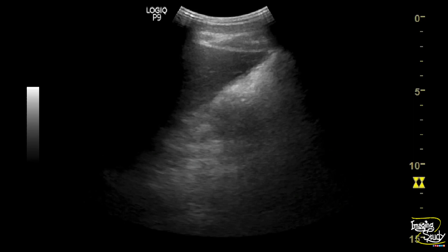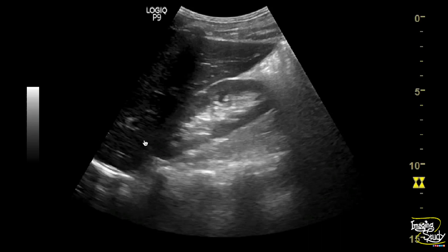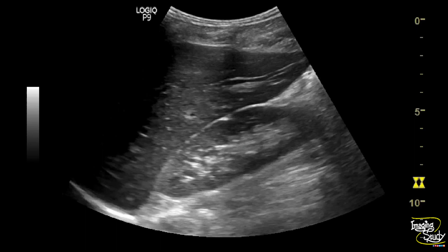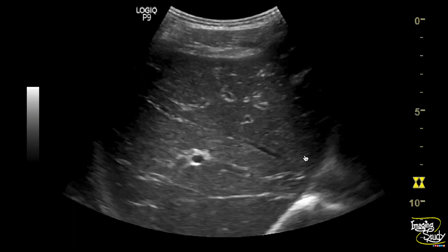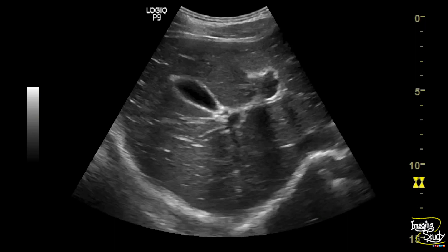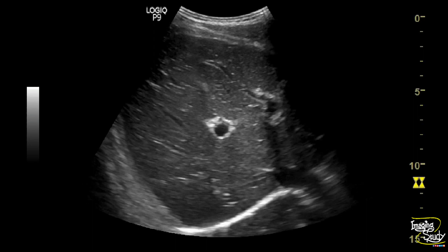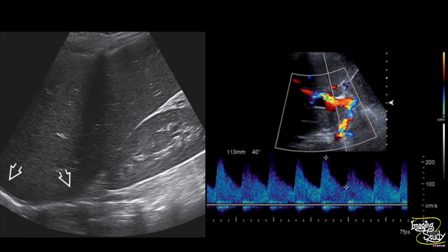Here is the kidney and you can see the hepatic parenchymal echogenicity is slightly decreased in comparison to the renal parenchyma. In this case the gallbladder wall was not thickened. Here again you can see the liver parenchymal echogenicity. In this longitudinal oblique transabdominal ultrasound in a case of acute alcoholic hepatitis, the liver is enlarged — looking at the longitudinal extension of the liver greater than the adjacent kidney, you can call it hepatomegaly, with a rounded contour also compatible with hepatomegaly.